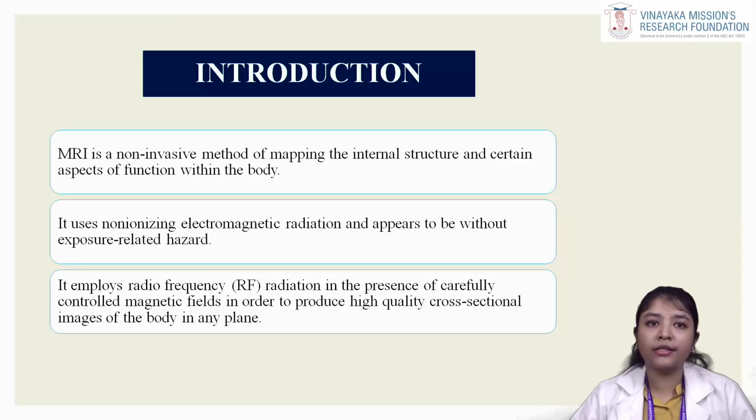So, magnetic resonance imaging has revolutionized medical imaging by providing detailed high-resolution images of soft tissues without ionizing radiation. While MRI is extensively used in neurology, orthopedics, and cardiology, its role in dentistry is emerging as a promising tool for diagnostic and treatment planning purposes.